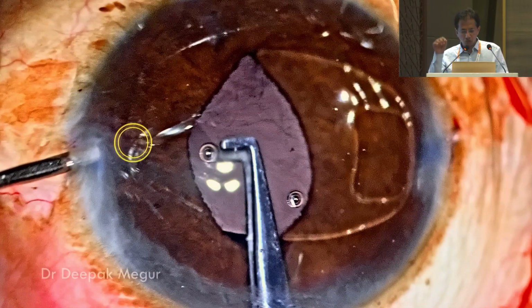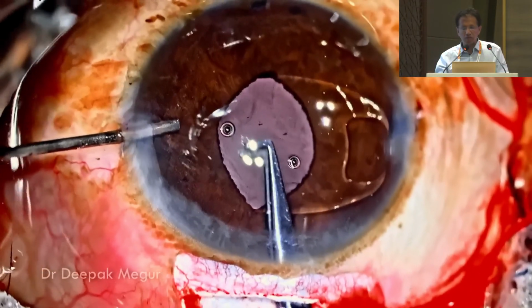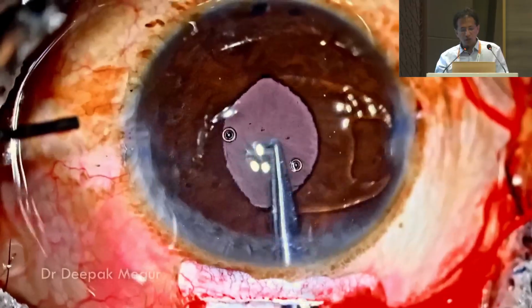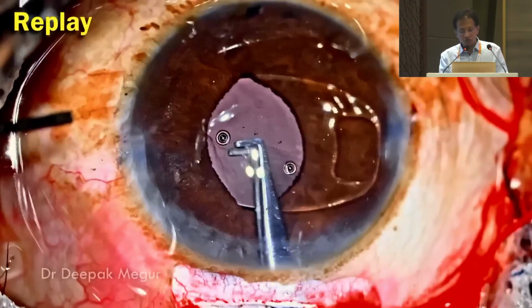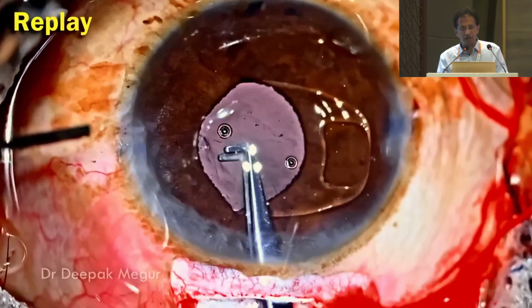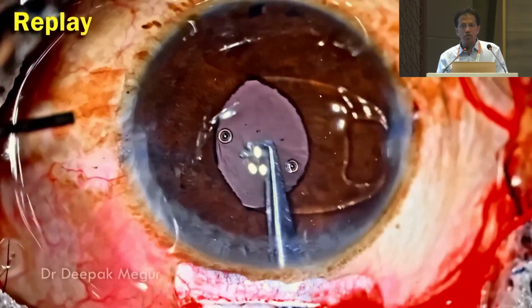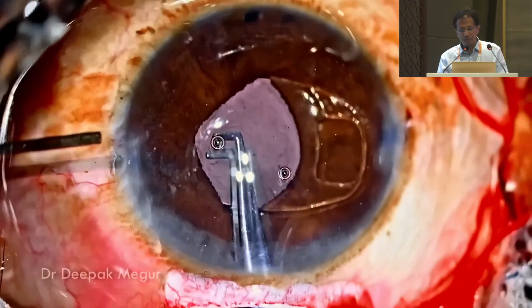So just a small nudge posteriorly, you see a knuckle developing there once the enclavation happens. I usually do it a couple more times so that you have a knuckle, and we want to ensure that it is truly enclaved. So I'm just trying to nudge it around, move it around, ensuring that it is truly there. So now I'm not worried that the lens is going to drop down when I'm trying to attempt the fixation of the second notch here.